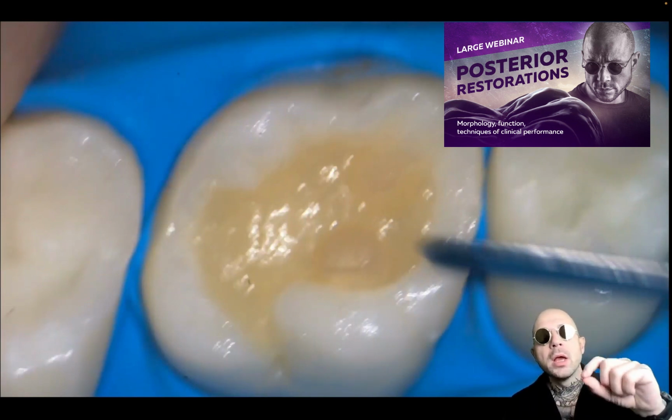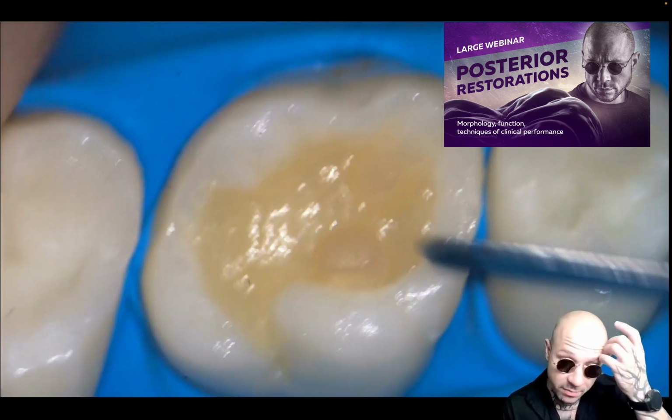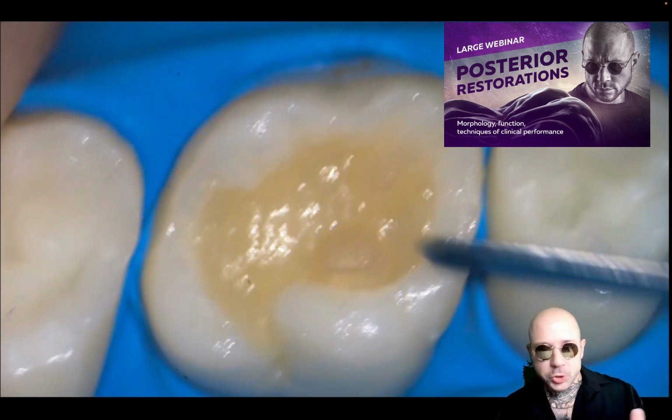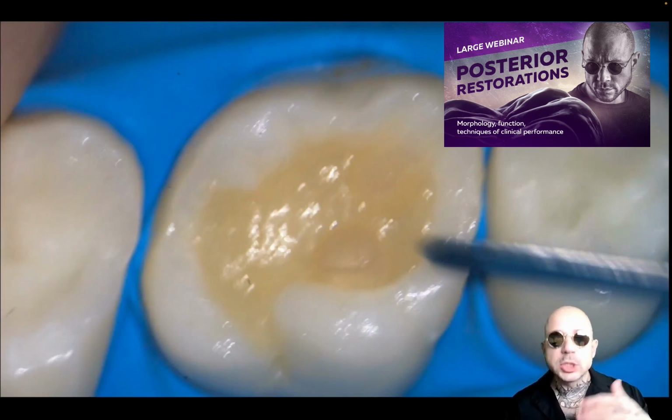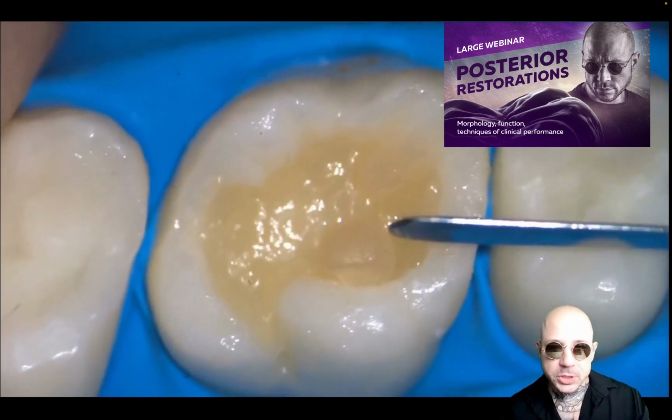They form a pike point, which sometimes is very important, and usually the central ridge is located and gets the biggest area. It dominates comparing with the nearby side ridges.